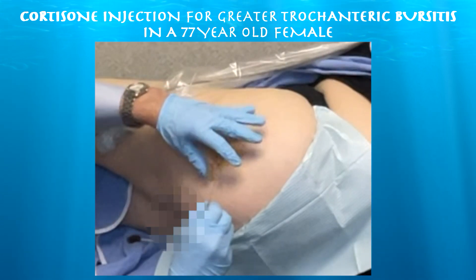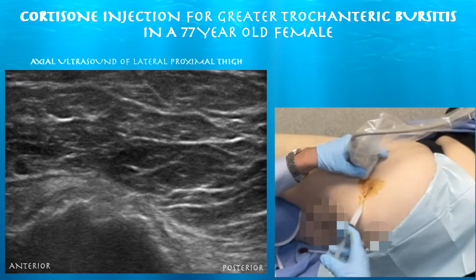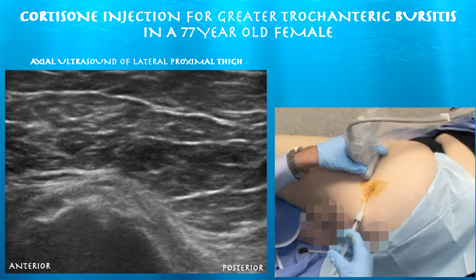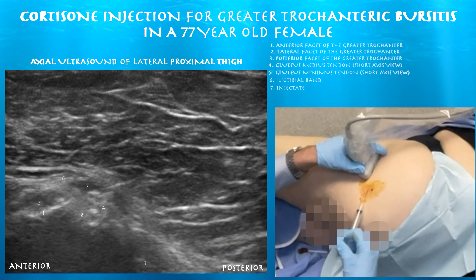Here we have our needle just under the iliotibial band, and now we're taking out the stylet from this 3½-inch spinal needle. Here we are attaching the cortisone, and you can see the needle tip just above the gluteus medius tendon, underneath the iliotibial band. We're creating that tissue plane between the iliotibial band and the underlying gluteus medius tendon.